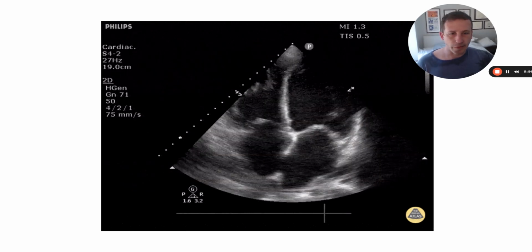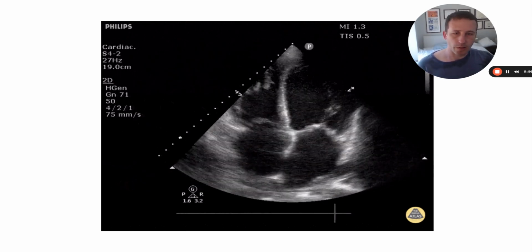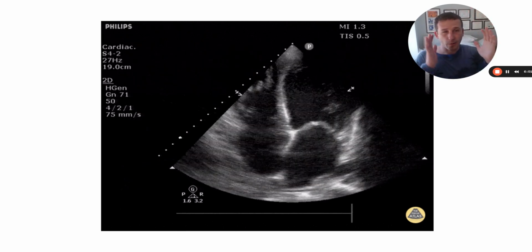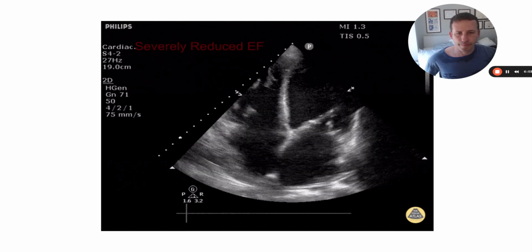And in this view, right, just very little motion. So we're not seeing those valves travel towards the apices very well. We're also not seeing the walls come together much at all.